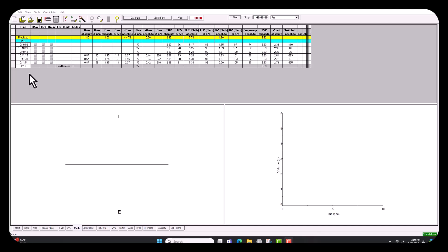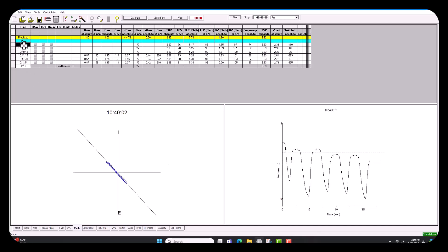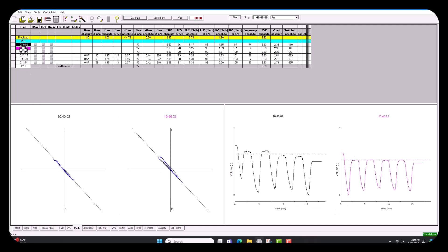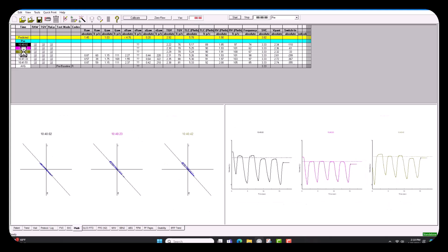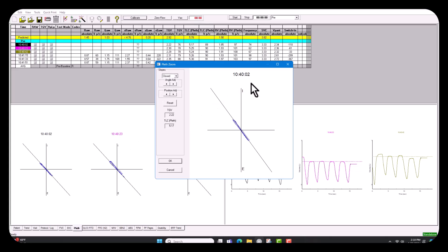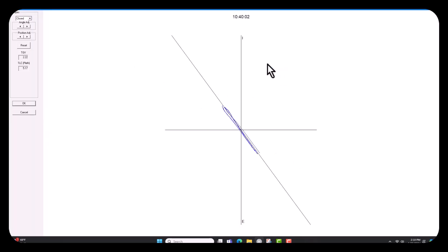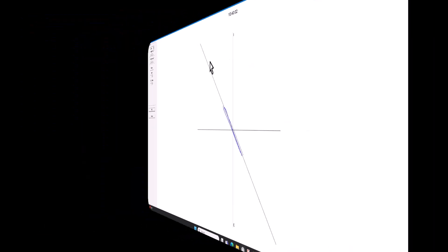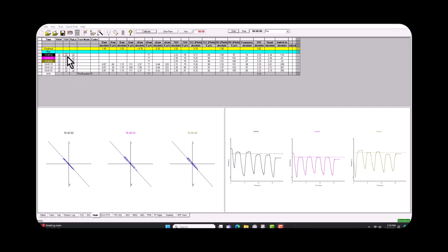While in the test screen, you can draw each effort if you double-click on the time of an effort. With the efforts drawn on the screen, you can visually see if any tracing needs adjustment. If a tracing needs adjustment, double-click on the graph to bring you to the adjustment screen. Note: always check the line of best fit before selecting efforts to average. Selecting an effort that has an inappropriate line of best fit will cause your lung volumes to be inaccurate.